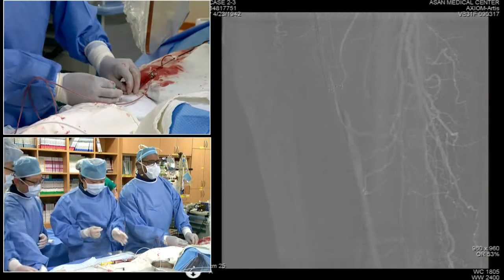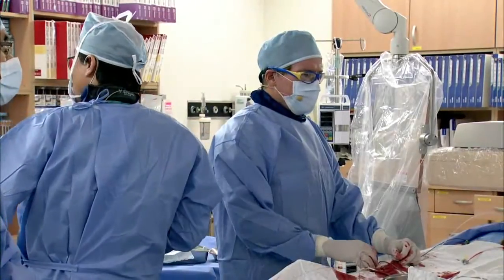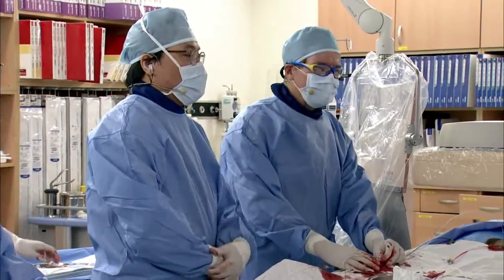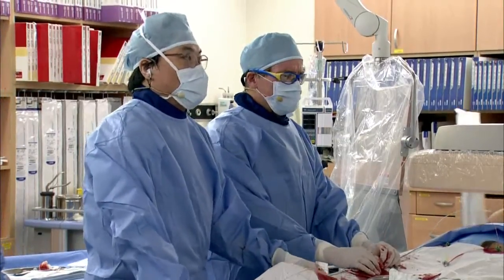Okay, thank you. Okay. 6 French or 6 French? Rich, can you hear us? Yes, I can hear you loud and clear. Thank God. Yes, and I'm here with Dr. Choi, and we have an interesting patient. Can we have somebody present this patient that we're working on?